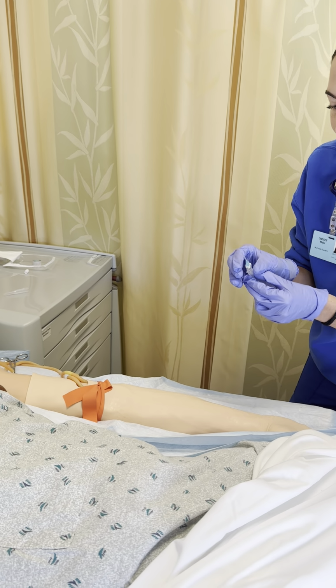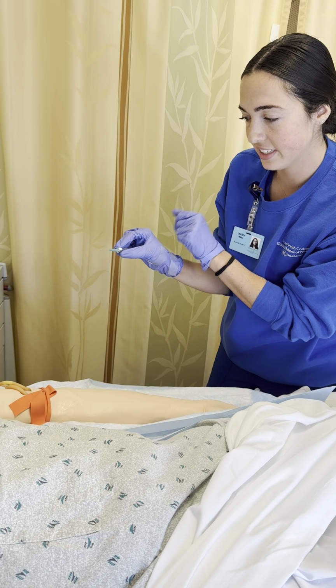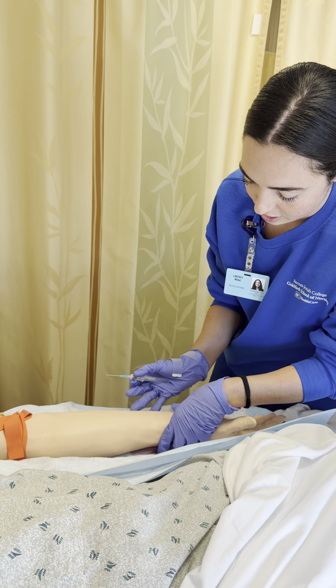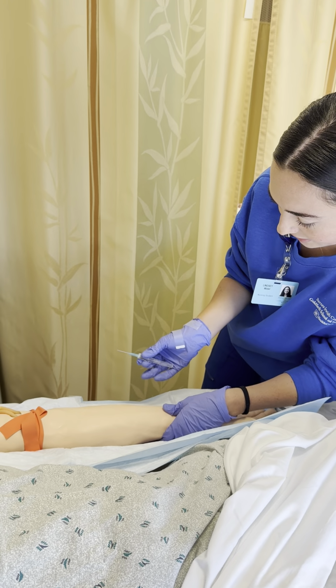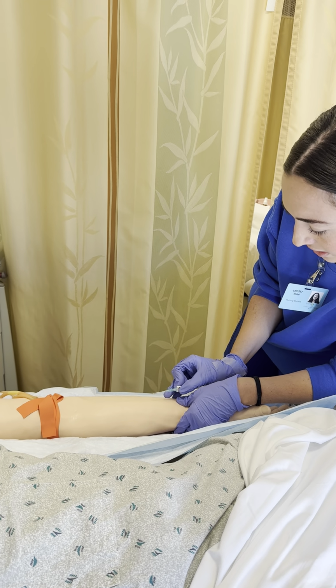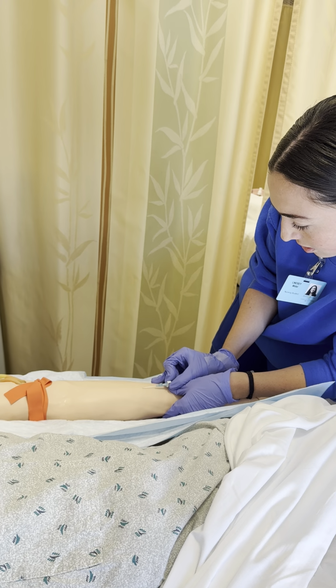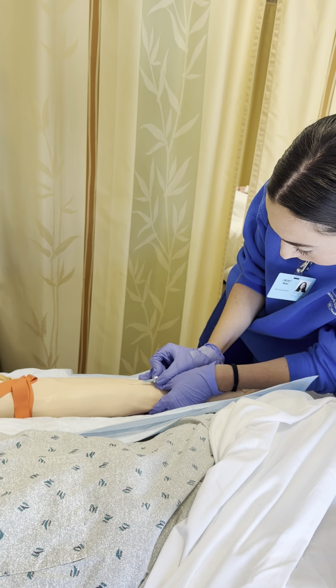Okay, so I got it uncapped. I'm not going to place my hand on the white because that is what pulls it back. So I'm just going to turn the arm over, make sure my hand's underneath of it and out of the way. I'm going to go at a very shallow angle. Go ahead and insert the needle now.